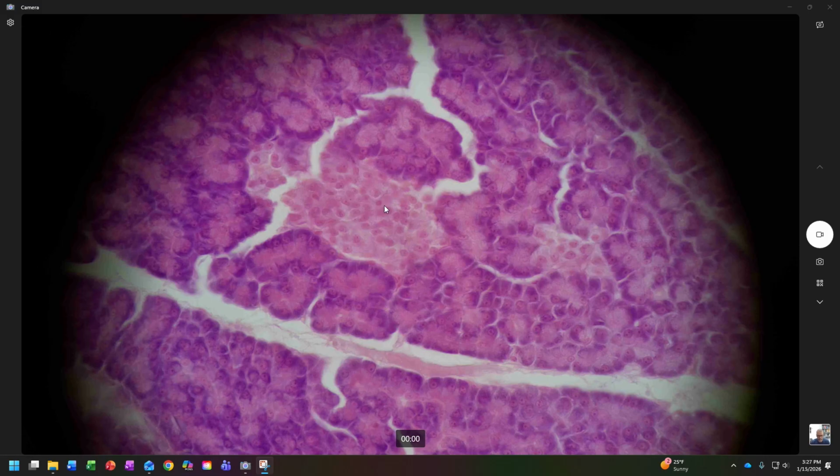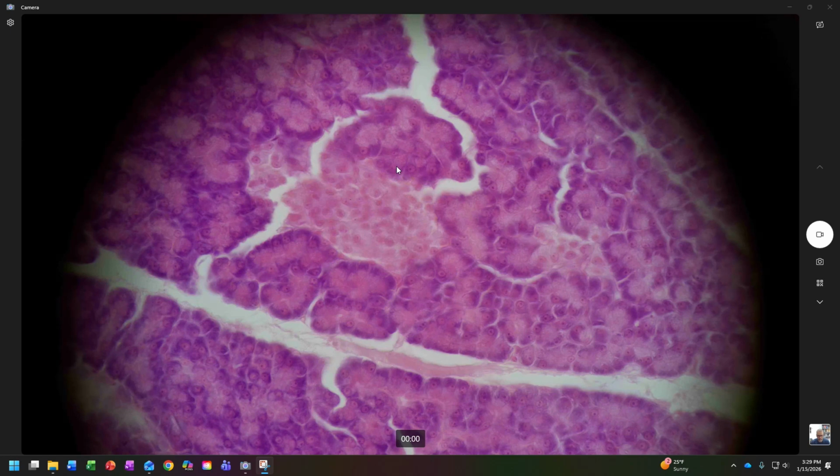The cytoplasm looks like the nuclei are probably the same color, but the cytoplasm is a lot more purple here. Here it's not little, but it's more pink. And for my students, the purpose is to just understand this is an islet right here, ISLET.